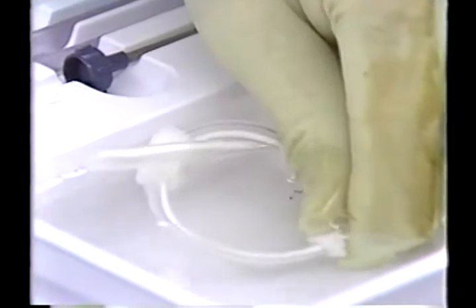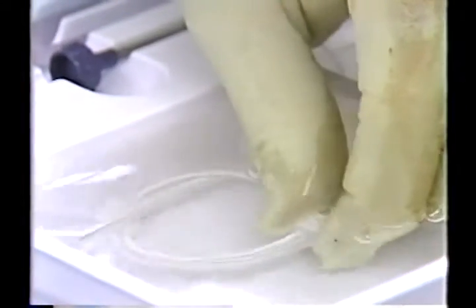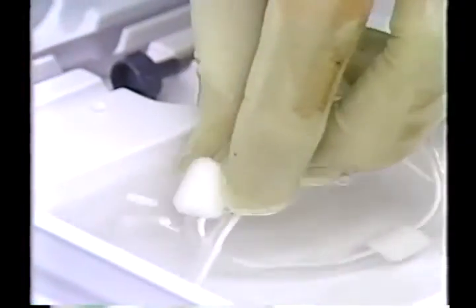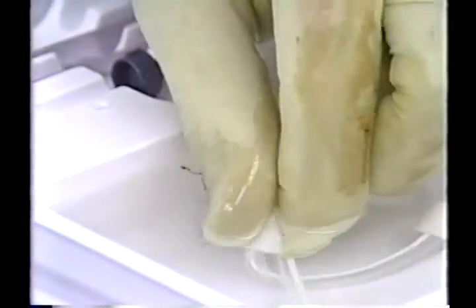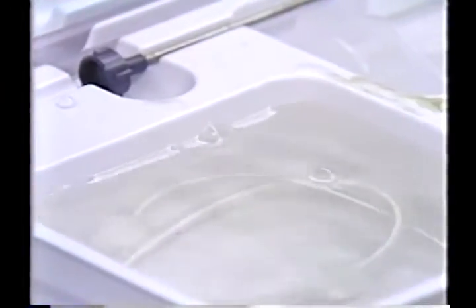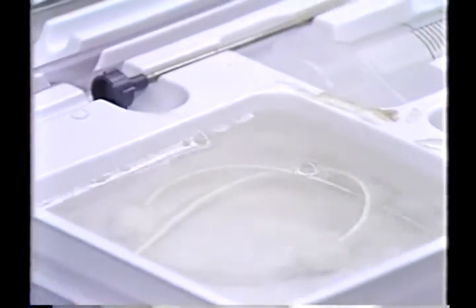This air removal is important since air inhibits the fibrous ingrowth to the Dacron cuffs. After several squeezes, the catheter should sink into the saline solution.